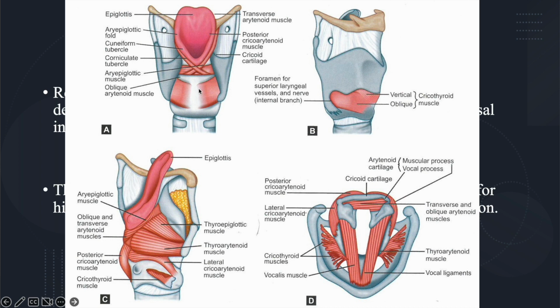You inflate the cuff, and there you have guided that endotracheal tube across the larynx, and you have established that definitive airway. And that's basically what the retrograde intubation is as well, but in the opposite direction. And for the retrograde intubation, it's a guided translaryngeal intubation.